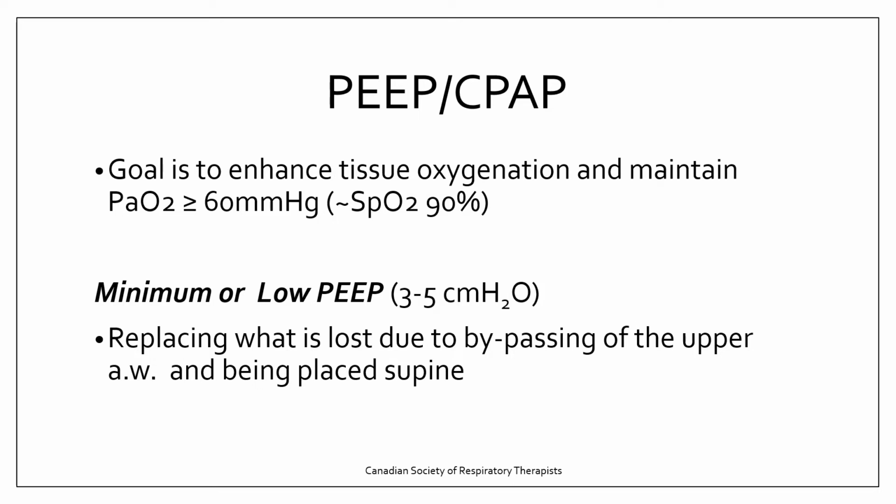Most of your patients, if there's no wildly difficult underlying pathology, having minimum PEEP of 3 to 5 centimeters of water pressure will be enough.